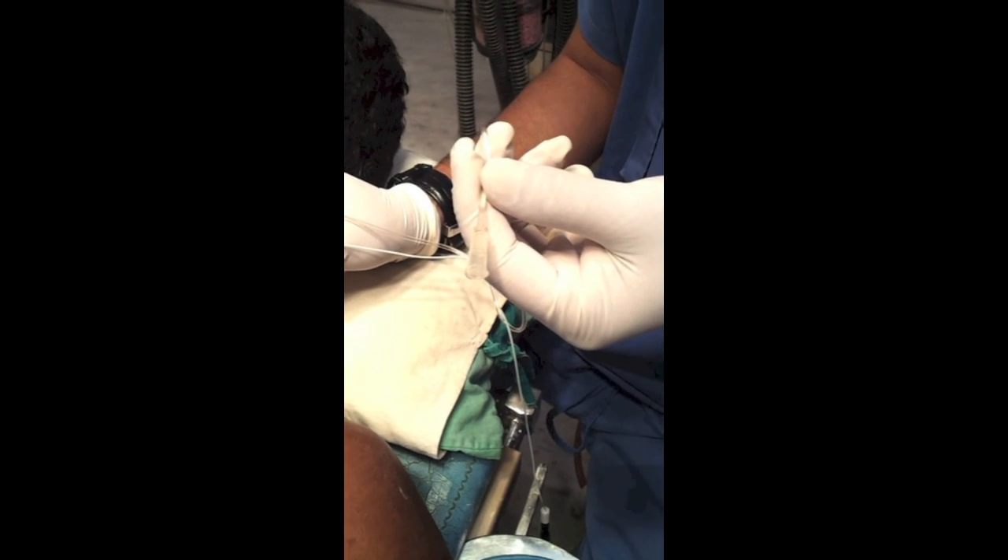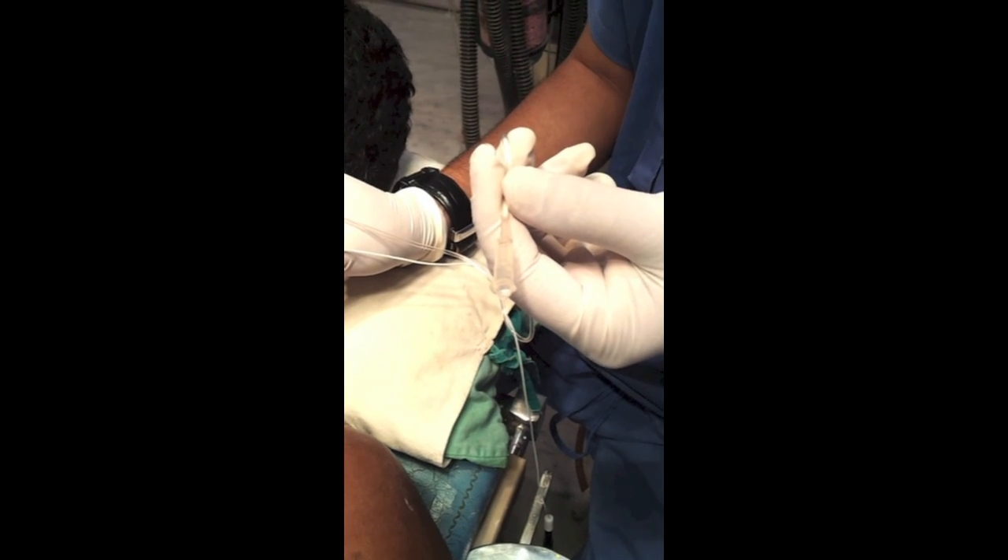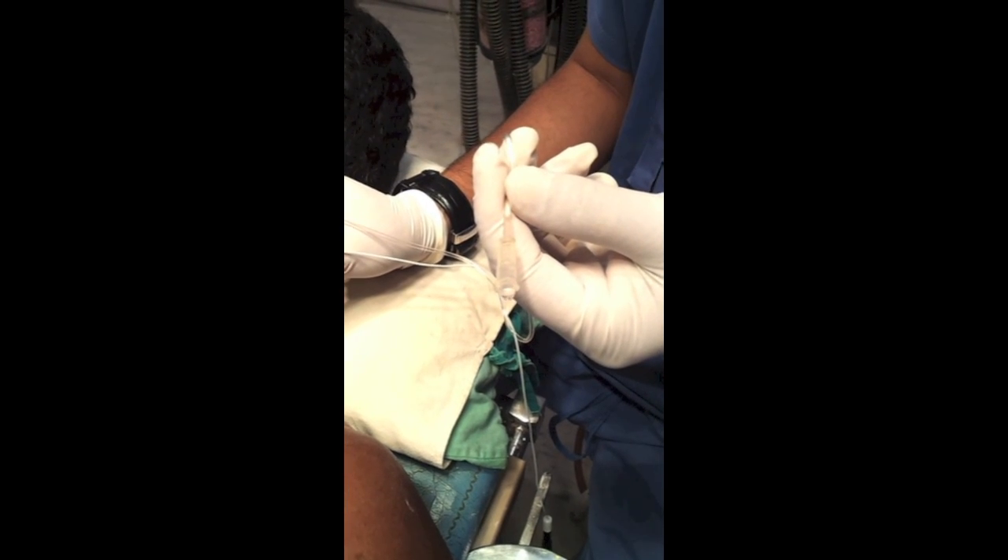After 20 minutes of local anesthetic administration, the block is in position and will definitely work.